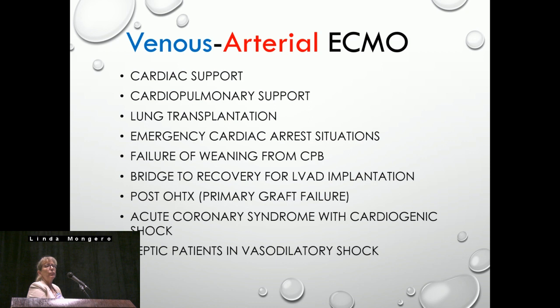V-A ECMO, this is what a lot of perfusionists post-cardiotomy are familiar with: cardiac support, cardiopulmonary support, lung transplant, emergency cardiac arrest situations, failure of weaning from cardiopulmonary bypass, bridge to recovery for LVAD implantation, primary graft failure, as I mentioned before, post-transplant, acute coronary syndrome with cardiogenic shock, so that's your call to the cath lab where they're resuscitating and you run there for ECMO.